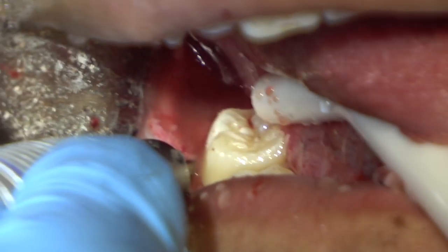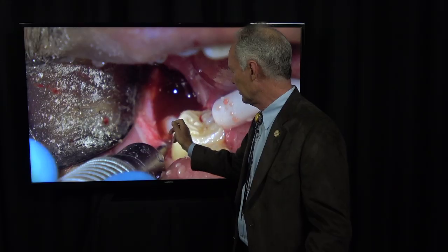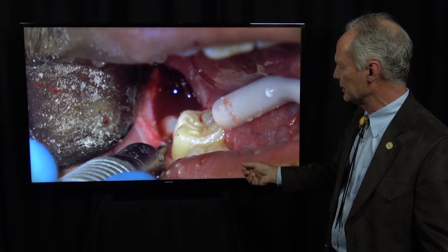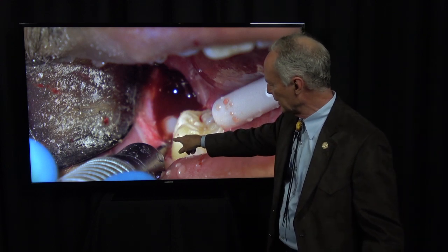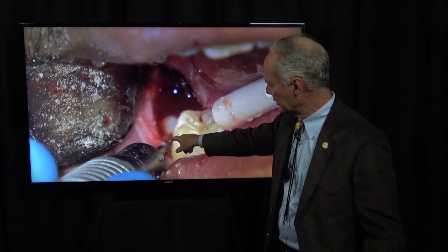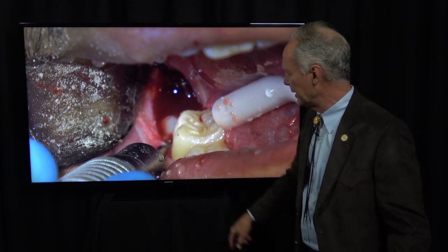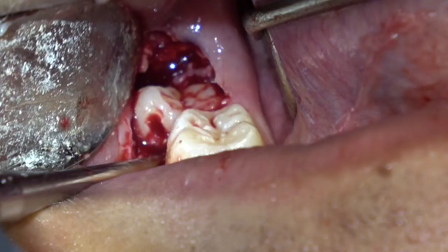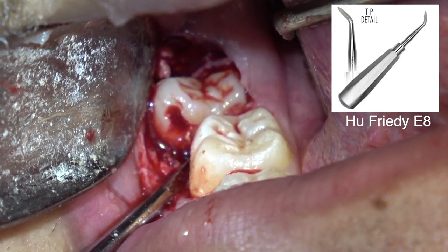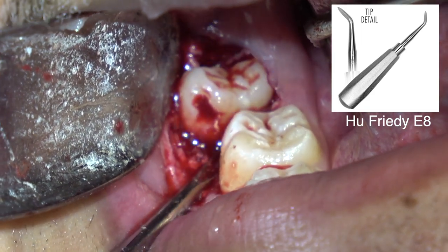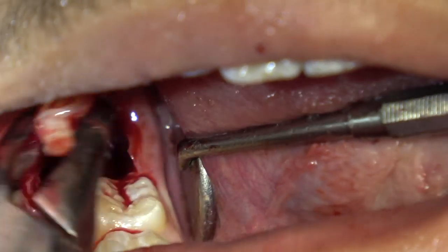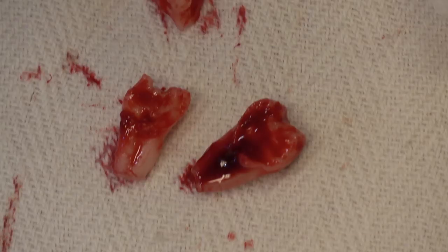Sometimes you can just place an elevator on the mesial and elevate that straight out. But in this case, I'm drilling a hole into the mesial facial aspect of that mesial part of the tooth and elevating it with the Hugh Freedy E8 — just put it in that hole and elevate it right out of there. That came out nicely.